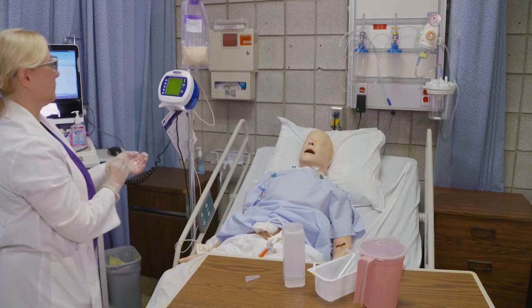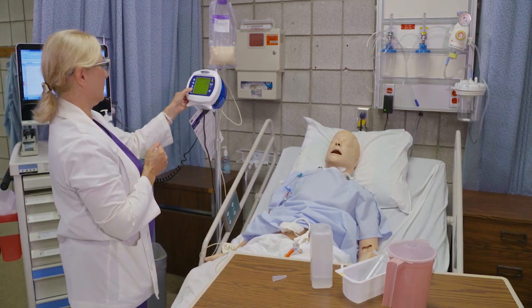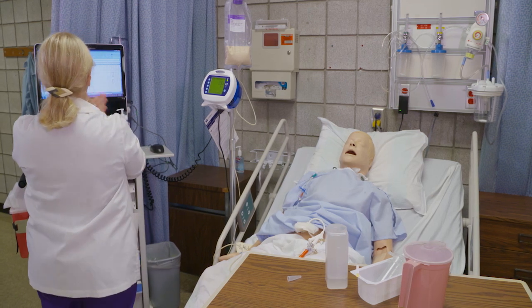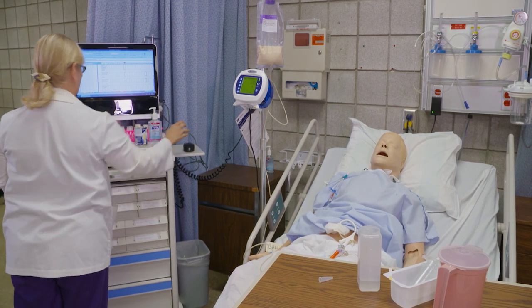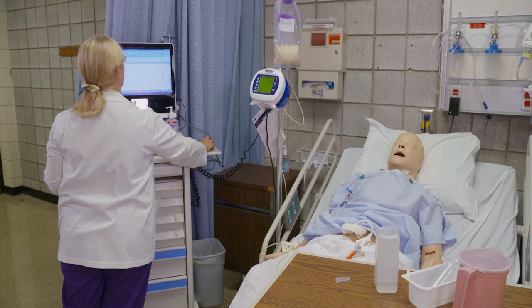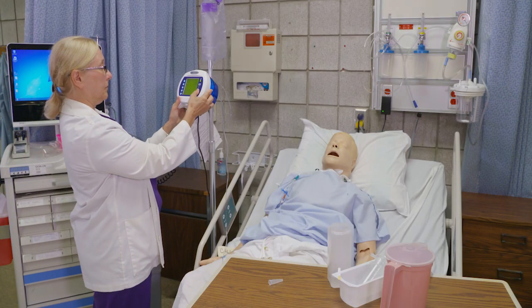Press the run button for the feeding to start infusing. Remove gloves and goggles. Complete hand hygiene. Complete documentation. The initial feeding was given at 0900 hours. X out of the screen using the red X in the top of the screen and do not save. When the feeding is completed, press the power button down and hold to power pump off.